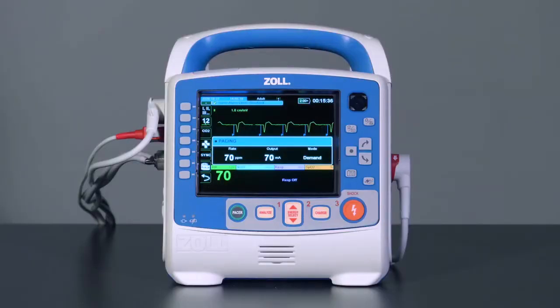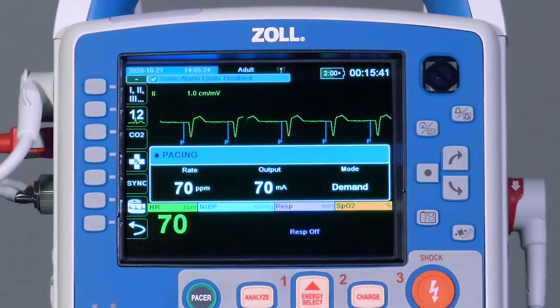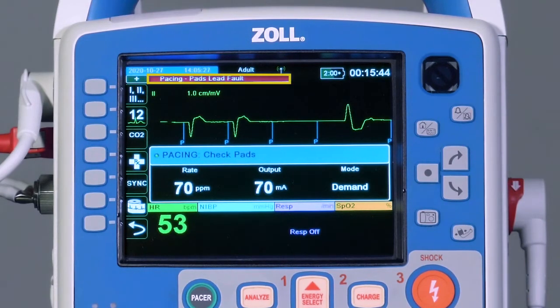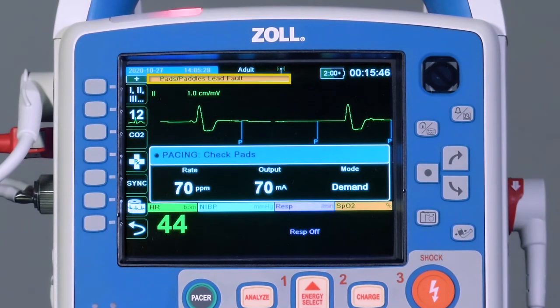If a multifunction pad is removed from the patient during demand pacing, the X-series Advanced will activate a high priority alarm and display a red alarm message: Pacing Pads Lead Fault.